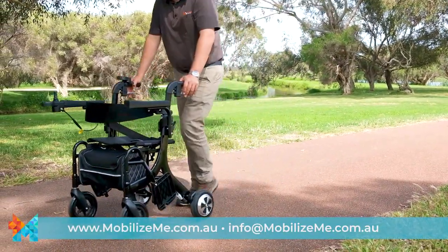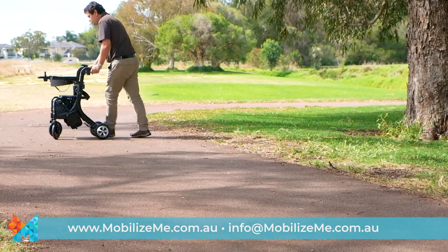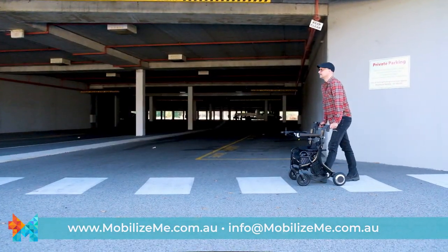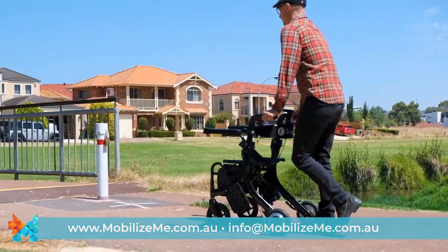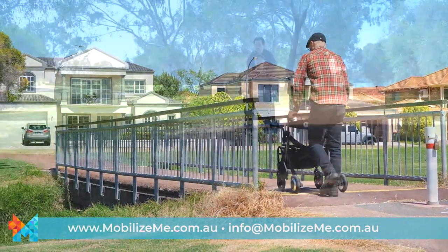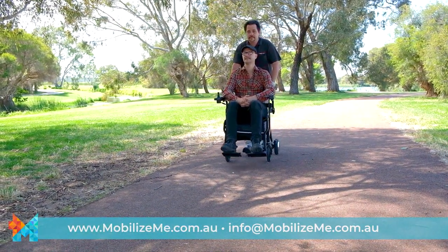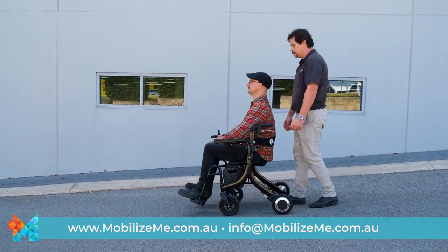Used as an electric rollator, the Evo shines, allowing for easier and safer travel up and down hills or transporting shopping thanks to the push-assist function. Alternatively, the Evo can be turned off and used as a manual rollator. The push-assist function is perfect if the user is tired or doesn't feel comfortable using the joystick in certain situations.